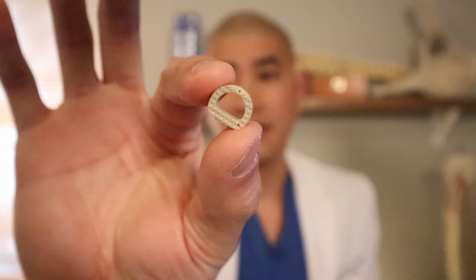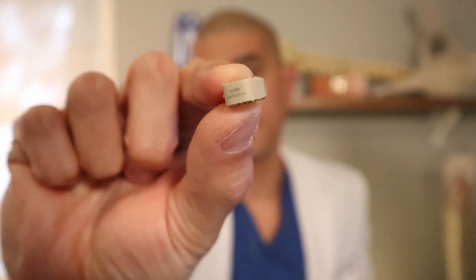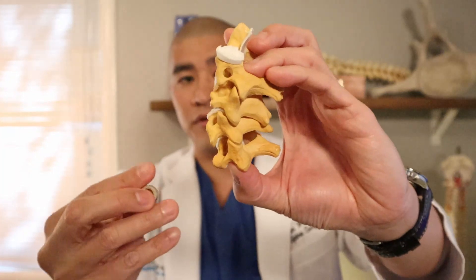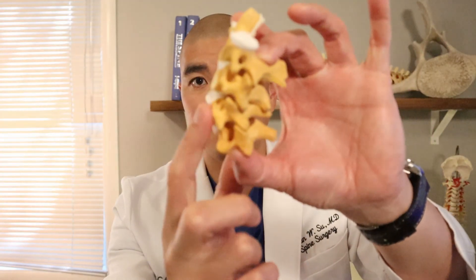The other option is a plastic or metal cage. Sometimes your surgeon will elect to use a cage, which often has a hole in it that can be filled with bone grafting substance. The cage is placed inside where the disc was and maintains the height of the disc space. The bone graft and cage are there so the bone can grow through and through for fusion.